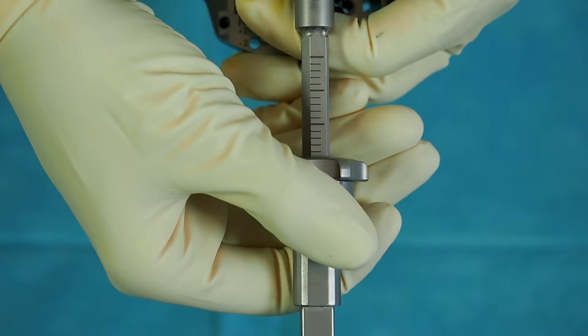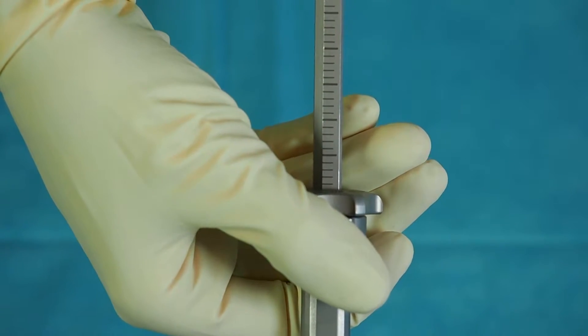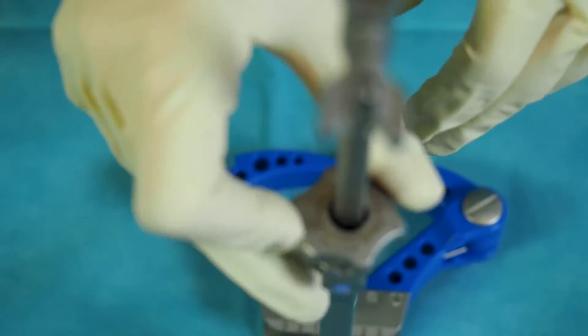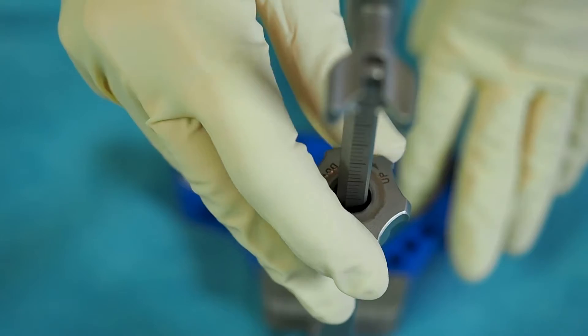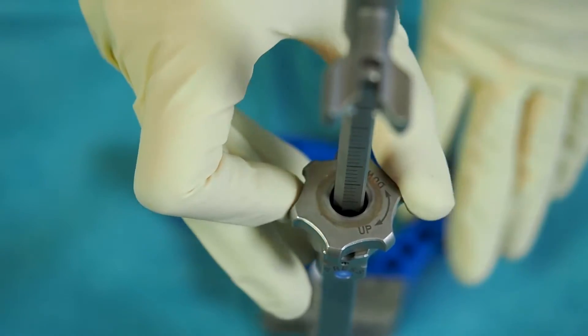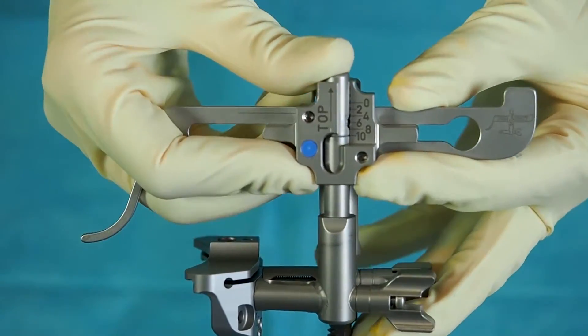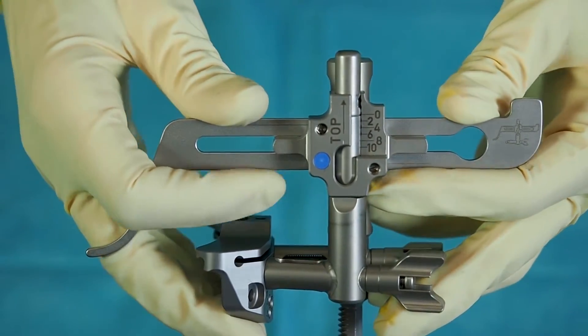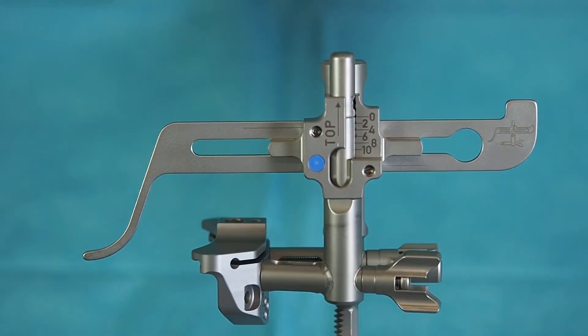For a rough height adjustment, press the adjusting wheel and move the assembly up and down. When turning the wheel, cutting height can be fine adjusted. The planned cutting height is set on the stylus. The alignment system must then be adjusted in height until the stylus is in contact with the desired reference.